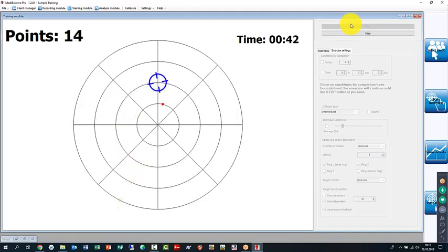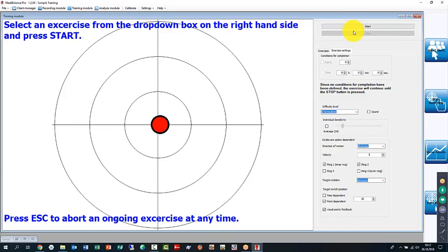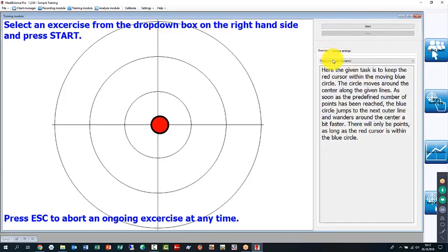So it's a lot harder to catch the points here and to even get more than 1 point consecutively. Once I've done my 20 points here, it will go back to the initial site and it will be easier. So I'm trying to demonstrate that. 1 more point, and there we go. And now I can relax a little bit again and do the same thing over in here, and so forth. And you can see 20 points in 1 minute, which is not too bad. And we're done with this exercise.